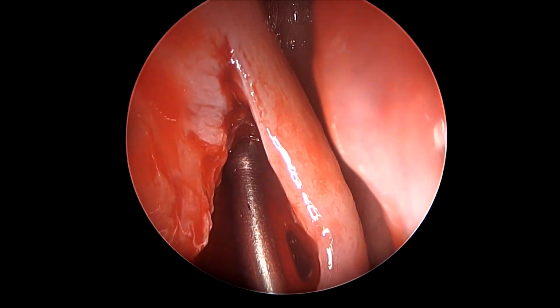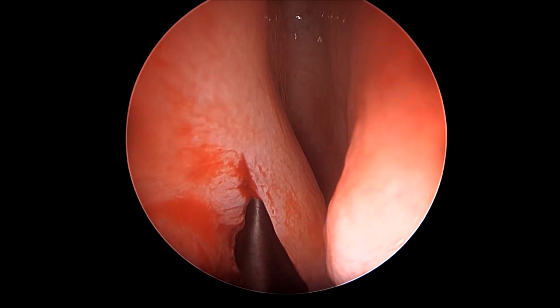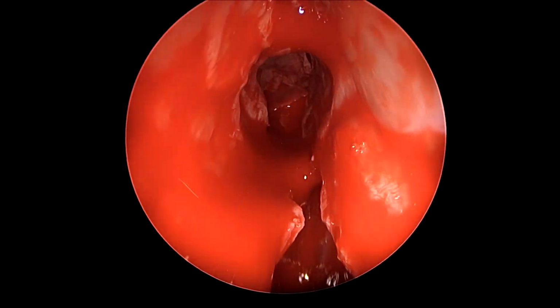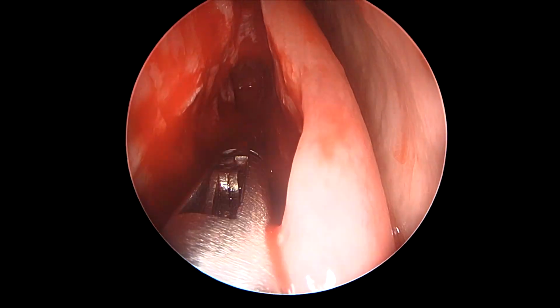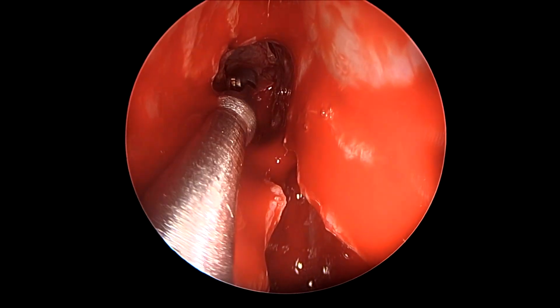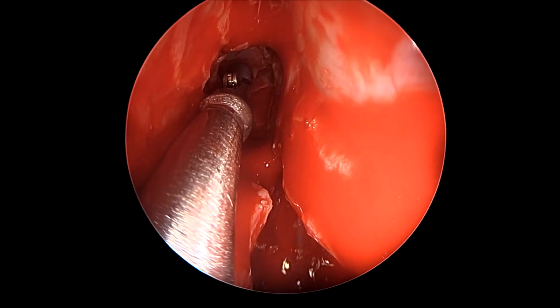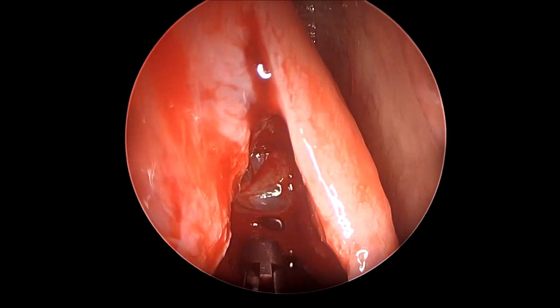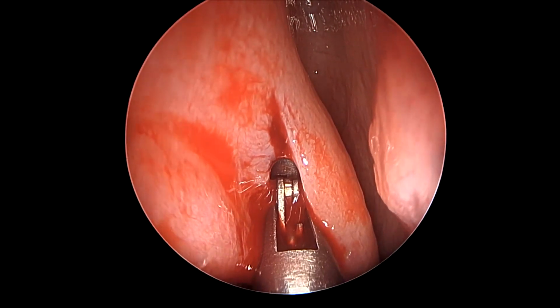Why? Because we can see the frontal beak and how our instrument is going just behind the frontal beak and has a very clear lateral trajectory from medial to lateral, to expose and make sure that the frontal sinus has been widely and reasonably opened. Excess or loose bony chips should be removed from this area, because otherwise they would lead to formation of granulation tissue, which would later lead to scar formation. And some excess polyps can also be cleared from this region.